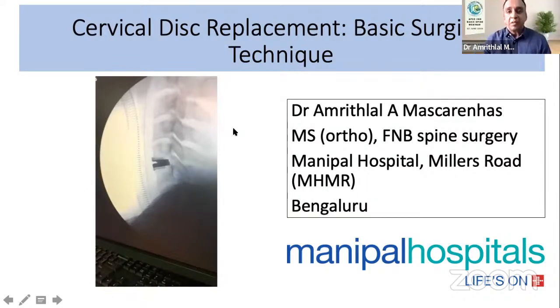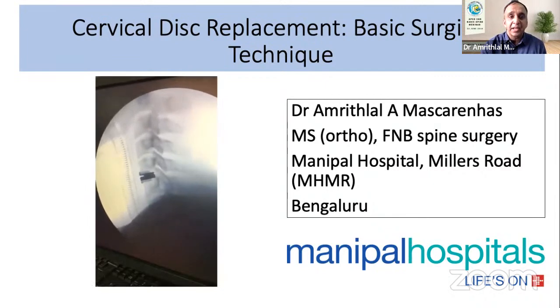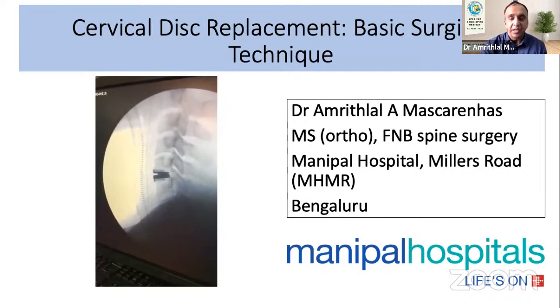Hi, I'm Dr. Amrithlal. Thank you very much for having me here. Just to make a case in point, there's this video here which shows post cervical disc replacement. You can see the nice movement of the disc space. So that is the whole purpose of doing a cervical disc arthroplasty.